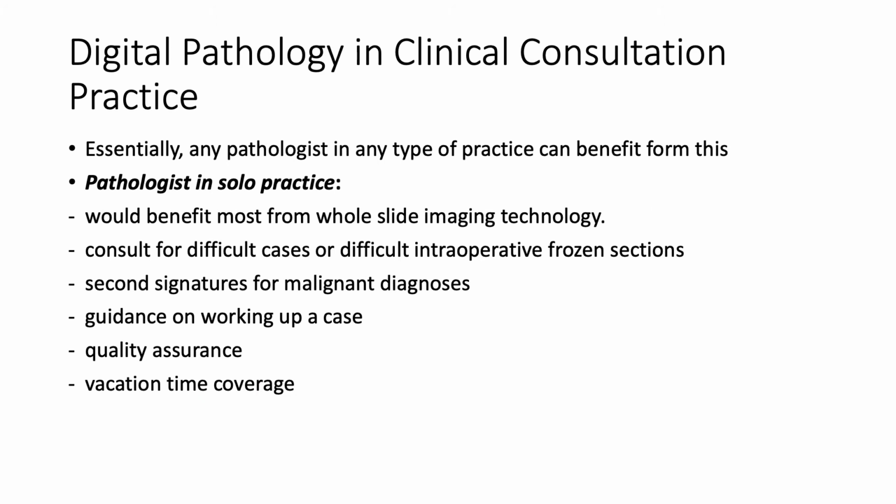Who would benefit from digital pathology in clinical pathology practice? Essentially, any pathologist, but solo pathology practice would benefit the most. Benefits would include consults for difficult cases or difficult intraoperative frozen sections, second signature for malignant diagnosis, guidance on working up a case, quality assurance, and vacation time coverage.